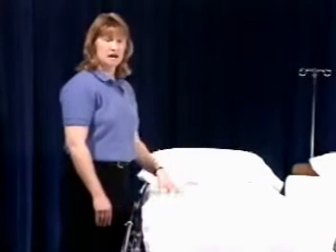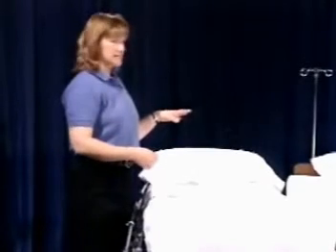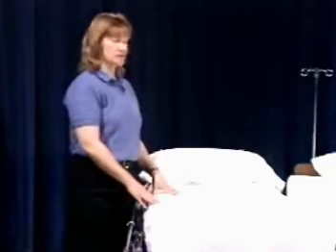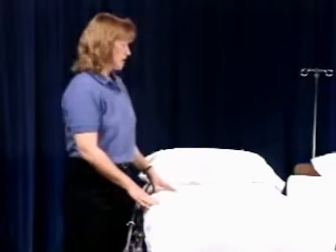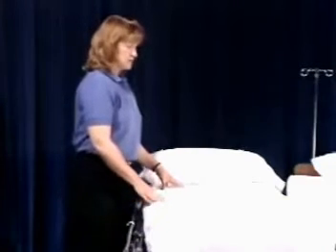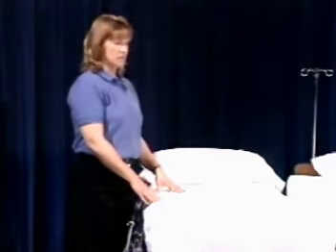You want to just make observation if this patient has got IV tubings or oxygen or a catheter tubing. You need to be aware of where that tubing is so you're not tugging on it or pulling it during the transfer. And when they go for a test, usually all of that equipment goes with them. So you need to make sure you've got it well prepared and you know what you're taking with you. Now with this type of transfer, you generally will need at least 4 to 6 caregivers to do the transfer, depending on the size of the patient.